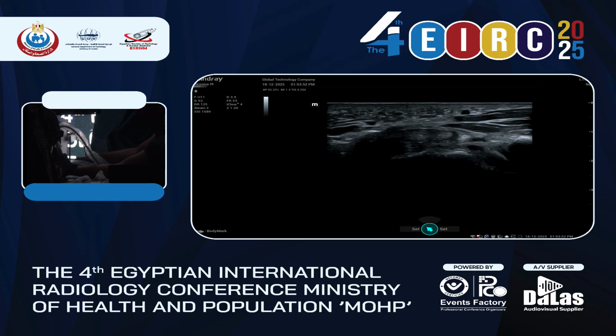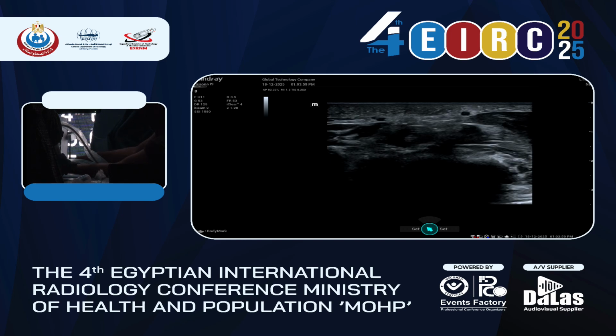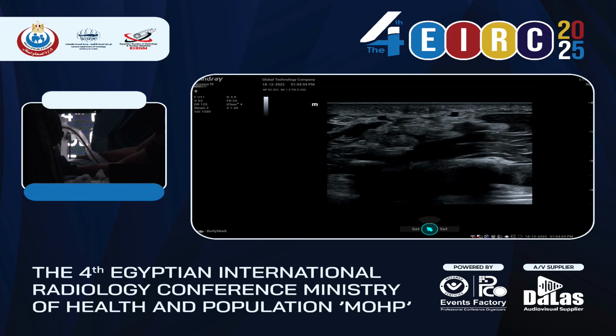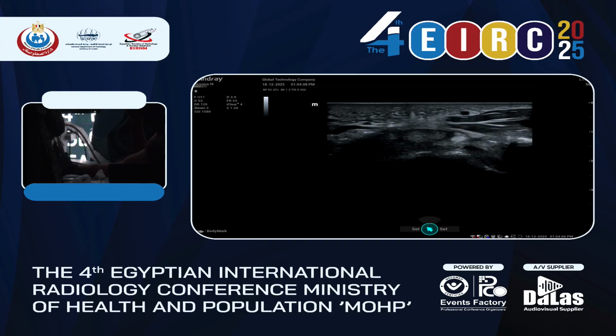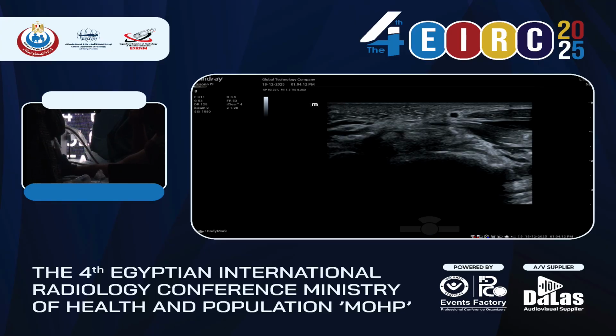And the nerve here is very flat, again, becomes flat before it gives the branches in the palm. So in the palm, here we see 3 branches for the 3 fingers. Okay? And here we have the nerve, which is flatter, because it is inside the carpal tunnel, here.